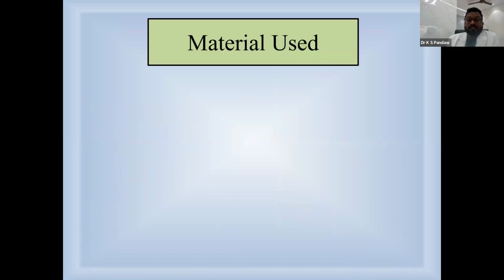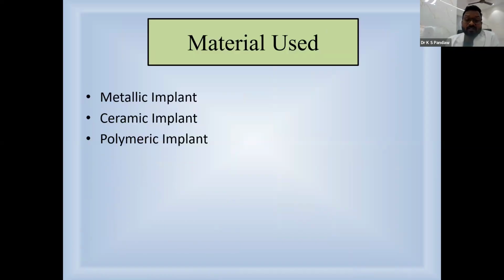And last, according to the material used: metallic implants, ceramic implants, and polymer implants. Most of us are using metallic implants. Titanium is used for the implants.